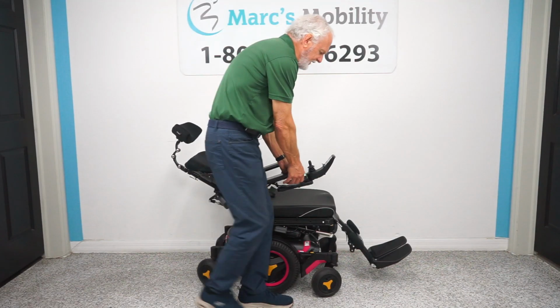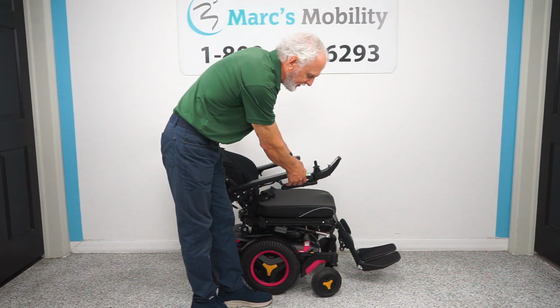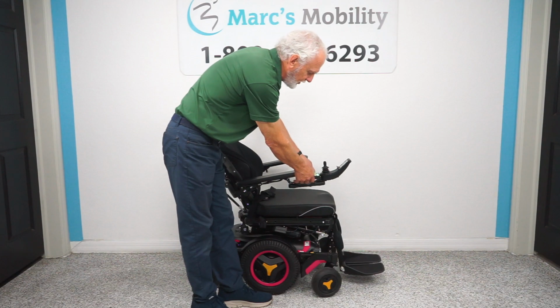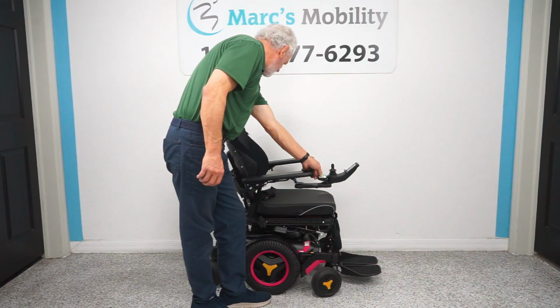So when you're outside, leave those legs out like that, but I'm going to bring them all the way in to show you what you should do in the house. Unless you have a super mansion, you're going to want to bring those legs in like that. I'm going to bring the seat back to a normal position here.